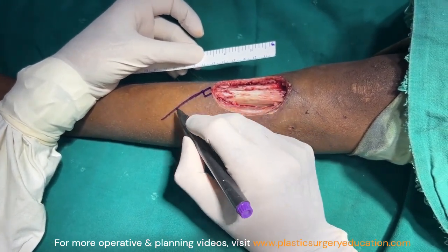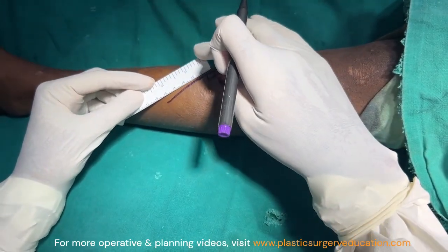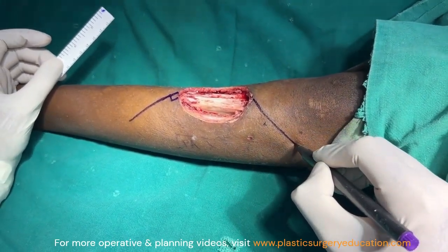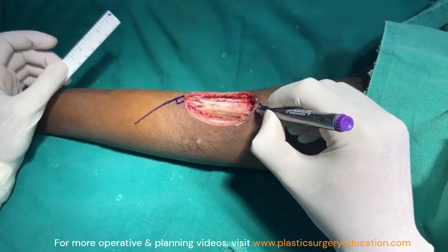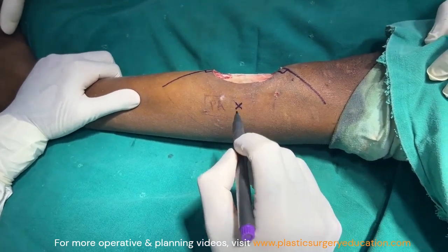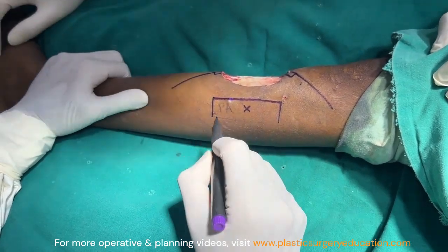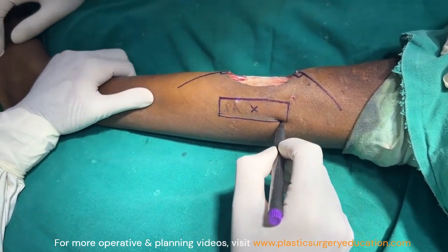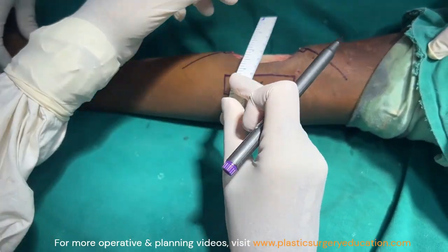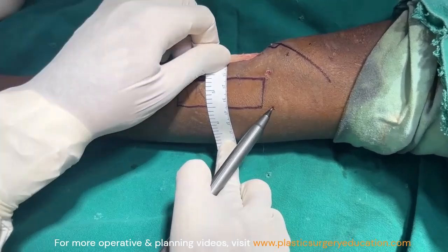We are specifically planning this keystone flap from the lateral side rather than the medial side. Generally we tend to plan it from the medial side, but in this particular case our incisions would transgress on the shin of the tibia more if we harvest from the medial side — that is why we are planning it laterally. What we are seeing here is the perforator marked beforehand. The lateral incisions marked are more than the combined vertical length of the defect.